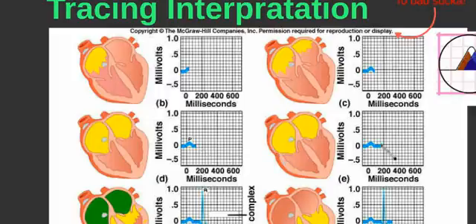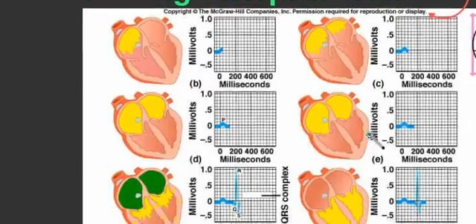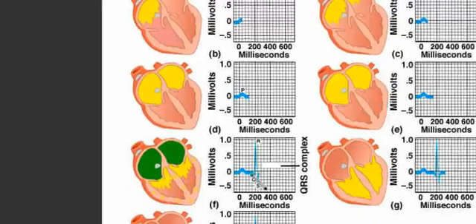And now we're going to have this PR interval, or some call it a PQ interval, because we are trying to get through that AV node, right? Trying to get through that AV node, hit that bundle, go through the Purkinje fibers into the ventricles. But first we have to hit that AV node, right? That AV that's sort of holding everything up. And once we get past that AV node, we're going to see something really dramatic, and that is depolarization of the cells inside the ventricles. So we see these ventricle cells begin to depolarize.